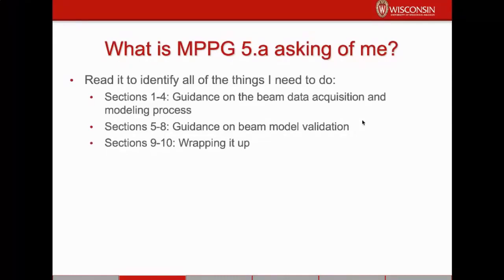So the first thing I did is I read it through cover to cover. Gratefully, most practice guidelines are pretty short, typically 15 to 20 pages, including references, whereas a typical task group these days might be 40 or 50 pages. So you can generally read these in one sitting and get the overall feeling for what needs to be done.